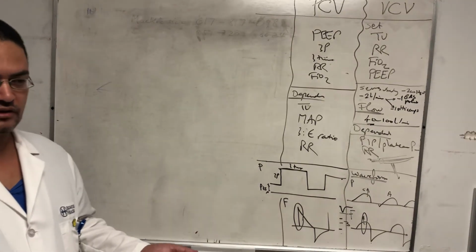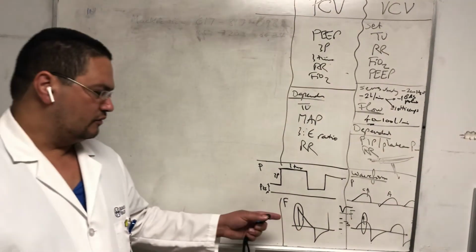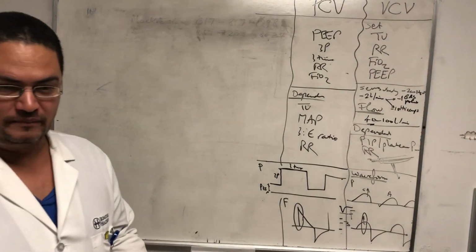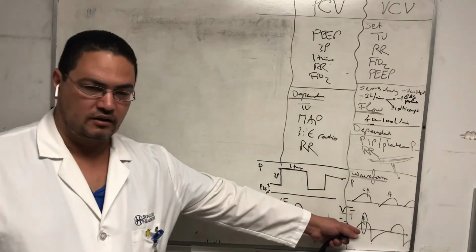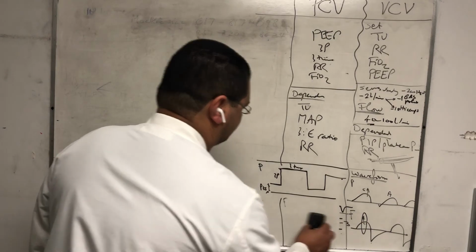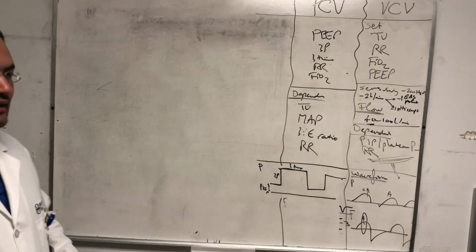So a lot of implications of that, but the point I want to make is, if you have a mode of ventilation that puts the oxygen in first and then decelerates, it's much better for oxygenation than just building up your breath like this. All right. And that is it.